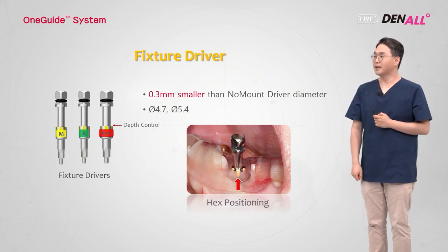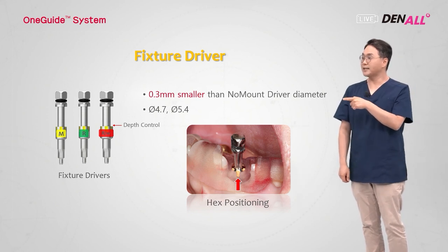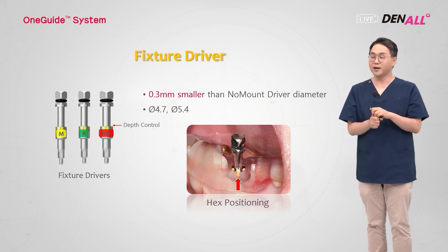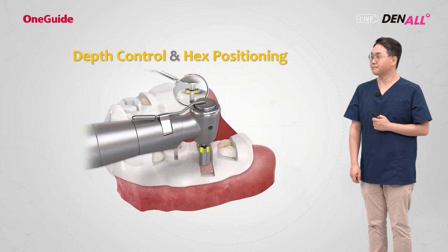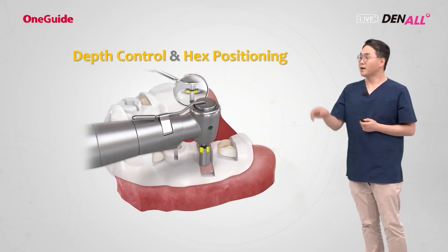That's my clinical tip. The yellow slot part should align with the guide hole. Then, as TS is an internal hex type implant, the internal hex can be positioned as planned. As you can see, here the fixture is not fully placed.